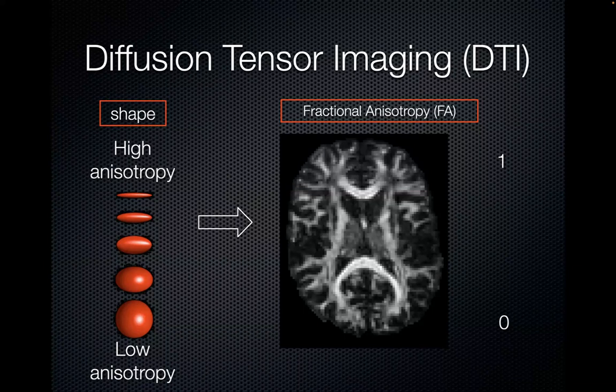But you can see in my message, I'm a big believer of all models are wrong, but some are useful. Very famous statistic quote. Even my more advanced models are wrong. They don't take into account astrocytes and oligodendrocytes and extracellular space properly. So FA and DTI is wrong. It doesn't model well crossing fibers, but it's useful.